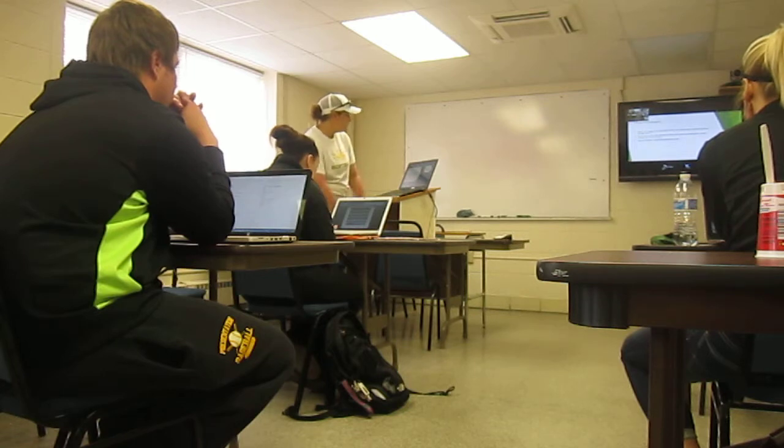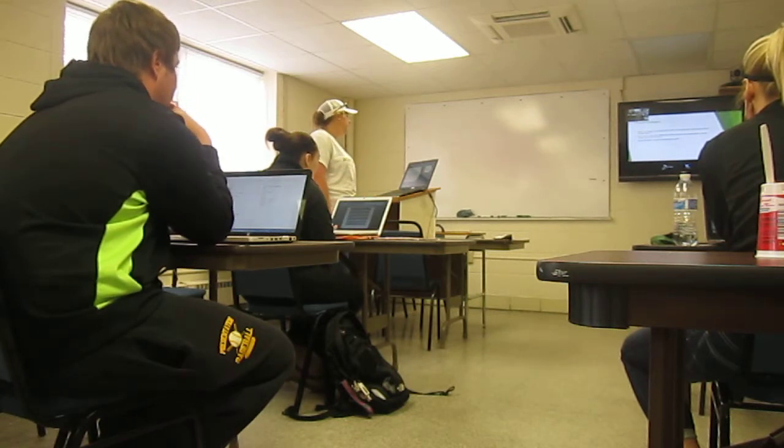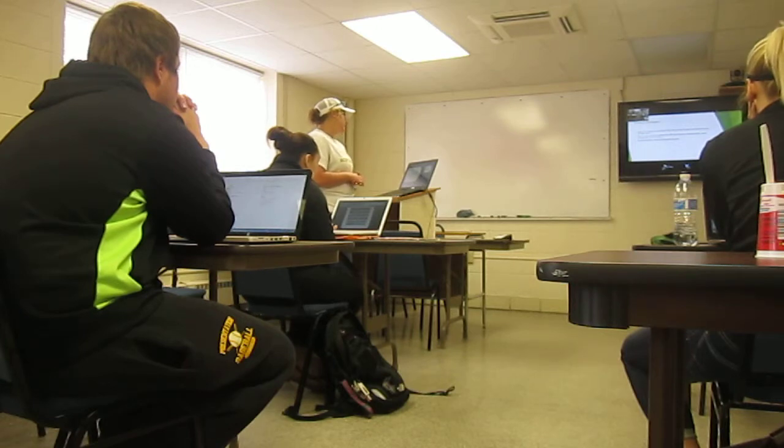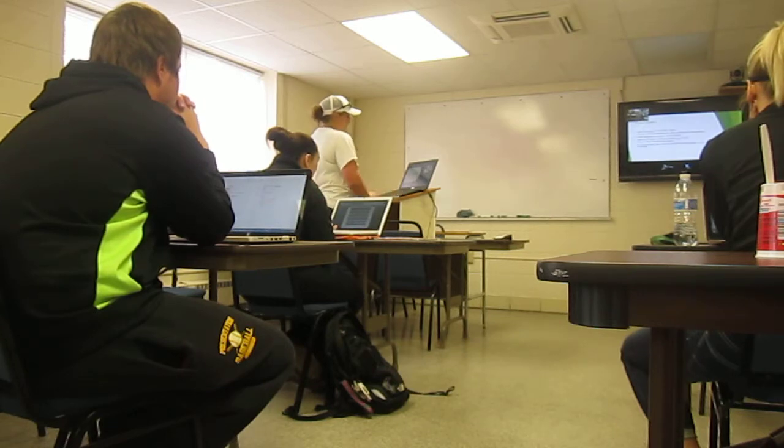There are advantages and disadvantages of breast tomosynthesis. The disadvantages are that when the images are produced, the files are much larger and will take up more space. Workstations are not suitable for digital breast tomosynthesis and require replacement, which would cost a lot of money, and special training would be required for staff.